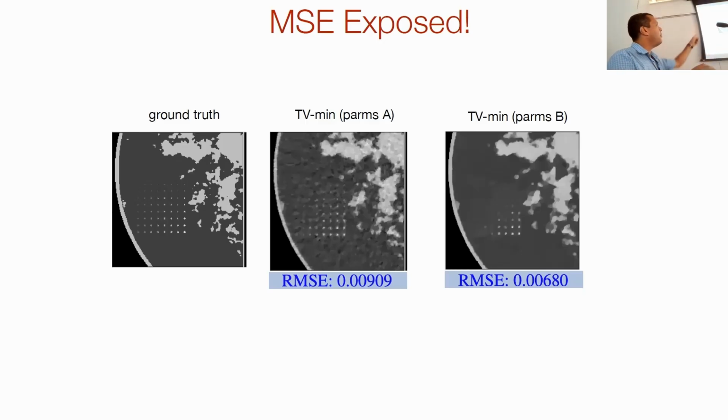On the bottom, you see the root mean square error for each of those reconstructed images, but then you can also visually see the contrast detail phantom, and you can see the reconstructed image with lower RMSE has many more of those signals wiped out than the one with the larger one. So, the pitfalls of MSE, just echoing Mark's point.